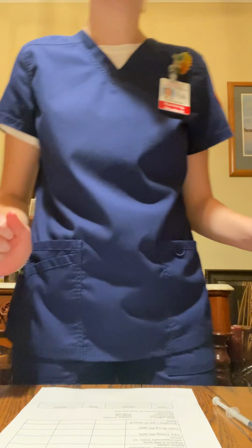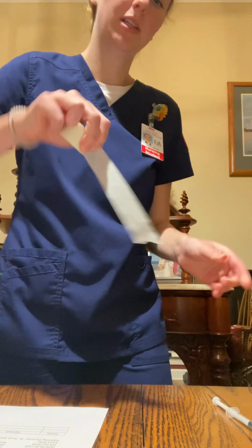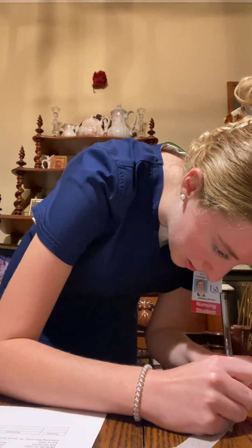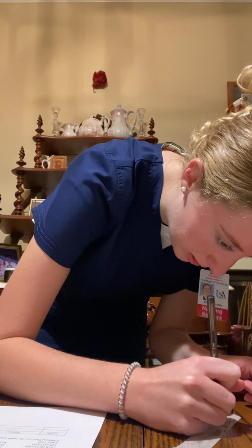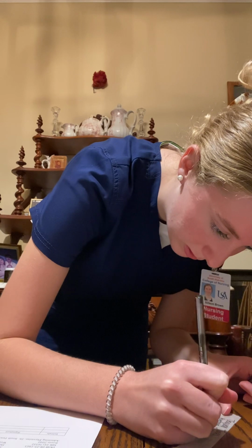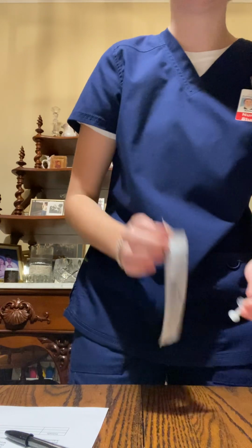So now what I'm going to do is prepare a label. On that label, I'm going to write my patient's name, the name of the medication, and then my dosage. So let me do that. The name of my patient is Jaguar Jones, and he is receiving heparin dosed at 5,000 units. And now I'm just going to place that on my syringe.